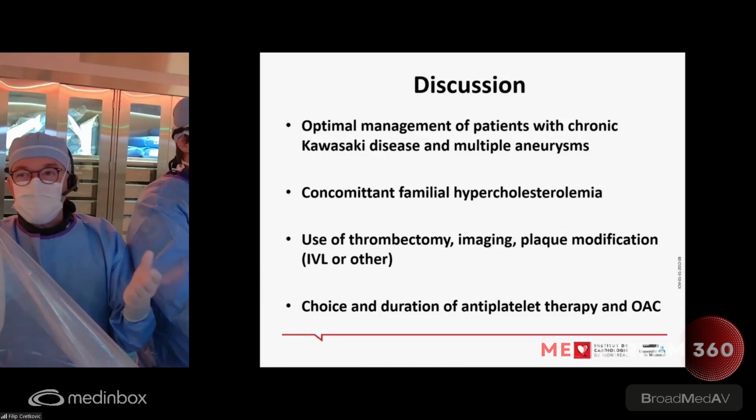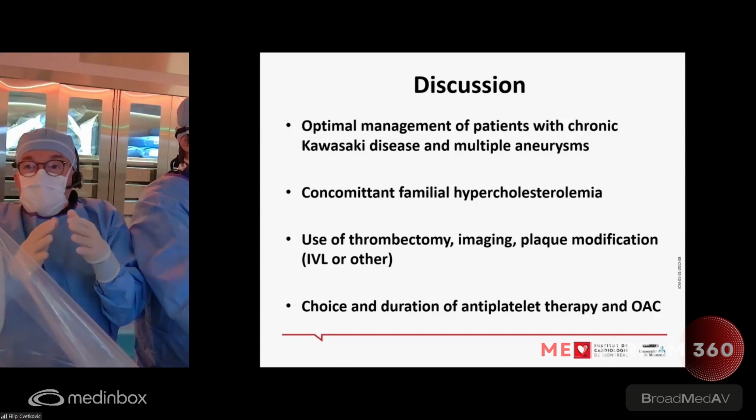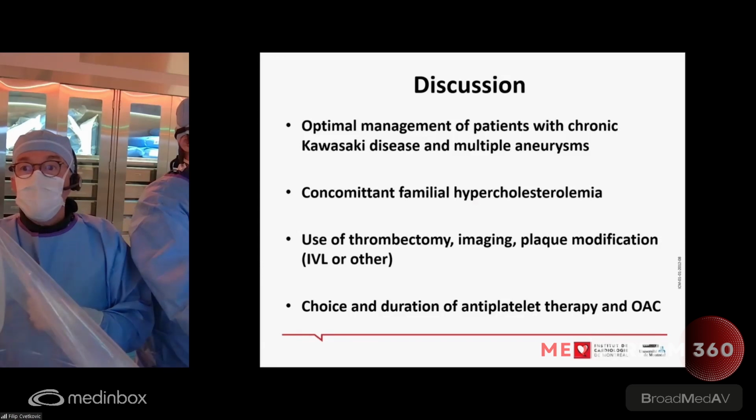In some calcified Kawasaki disease, we could consider, if it's superficial calcium, using a rotational atherectomy or orbital atherectomy, or if it's deeper, because there's disease of the media, I mean, it's a vasculitis, we could consider, even though the data is limited, intravascular lithotripsy.